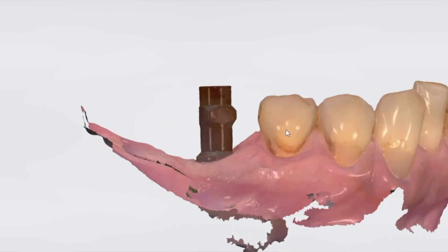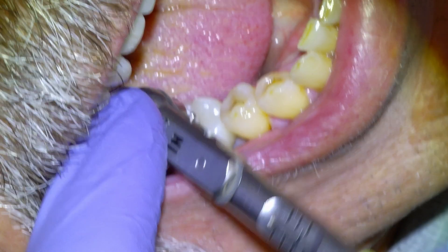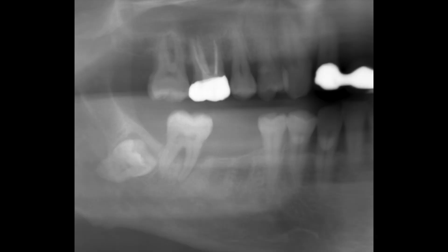Hey guys, Dr. Dobson, and in this one we're going to do the manufacturing and installation of a dental implant crown. This is a patient that presented with a missing lower right first molar, and the second molar had pretty bad gum disease — about class 2 mobility — and was not a suitable bridge anchor, so we decided to place a dental implant in the 4-6 site. The wisdom tooth in the lower right does not need to be removed, so we just left it.